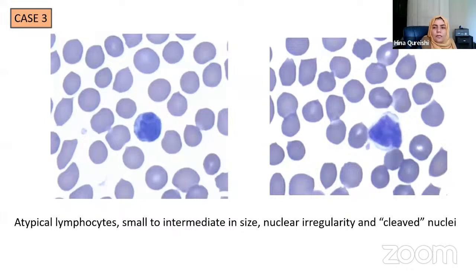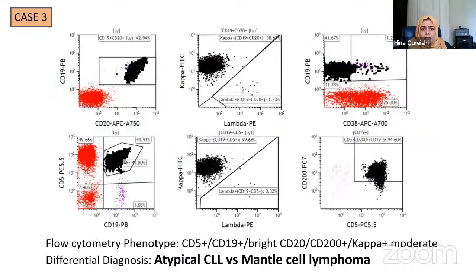Peripheral blood smear review is showing these cells that are slightly different than the case number 2. These cells actually have nuclear irregularity. If you can appreciate that there's actually a dip or a cleft in the nucleus and folds in the nucleus. Here again, if you trace the edge of the nuclear membrane, you'll see these dips and clefts. So these are subtle changes that pathologists are actually used to identifying on the smears, and they can identify these atypical cells circulating in the peripheral blood. So once you see these atypical cells, then again, flow cytometry is recommended in this patient.